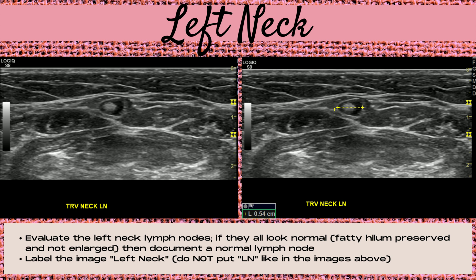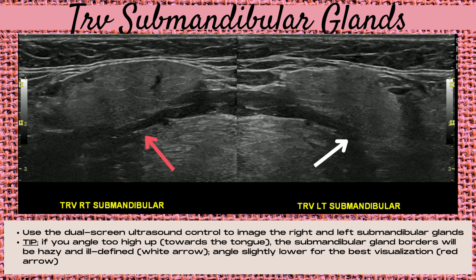Next, move on to the submandibular glands, imaged in the transverse plane. Find them by moving the transducer transversely under the chin and sliding slightly lateral. Use the dual screen control to image the right submandibular gland on one side and the left on the other. Pro tip: if you angle up too high towards the tongue, the submandibular gland borders will be hazy and ill-defined, as shown by the white arrow on the left gland. If you angle slightly lower, you get the best visualization of the borders, as shown by the red arrow on the right gland.